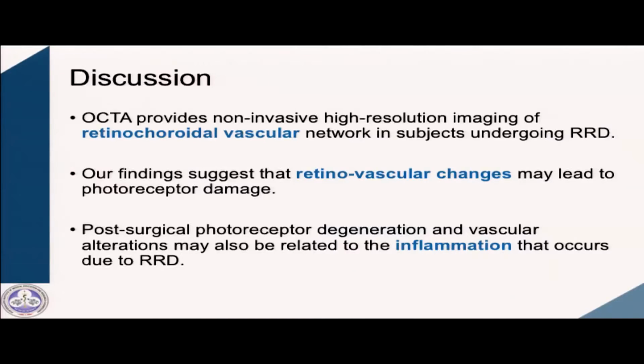So OCTA does provide a non-invasive, high-resolution imaging of the retinocoroidal vascular network, and our findings suggest that these vascular changes have a significant role in patients who develop suboptimal visual recovery following successful surgery. Thank you very much.